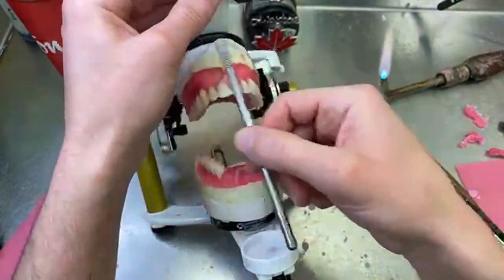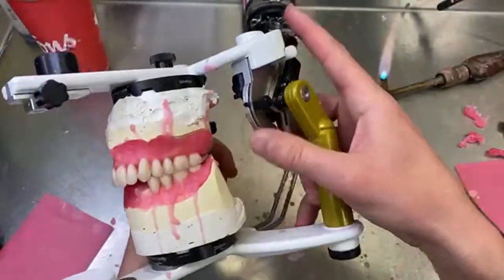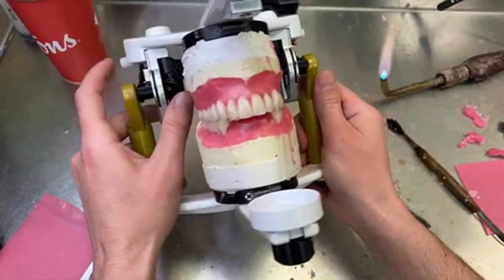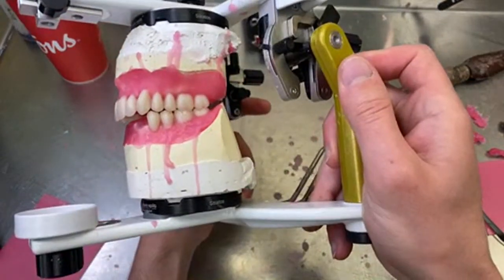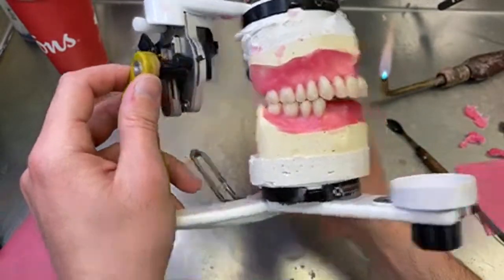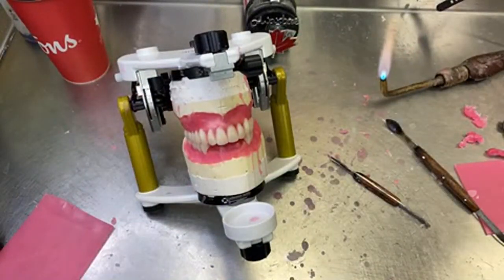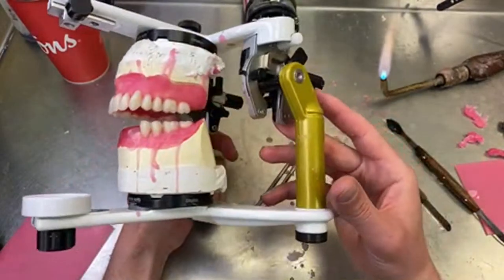So now I can remove this. The wax is still soft, just don't press too hard. I'm just gonna do a little side to side. Everything is touching. And then some tweaking will be needed once you add the anteriors, because you will have the canines of the lower that will also determine the sliding and lateral excursions.